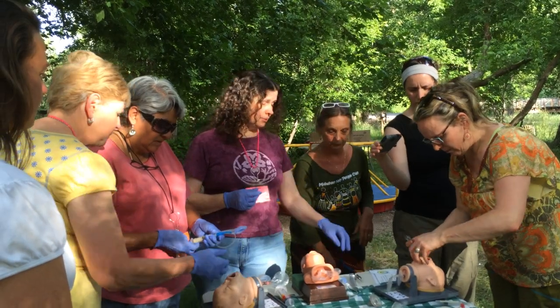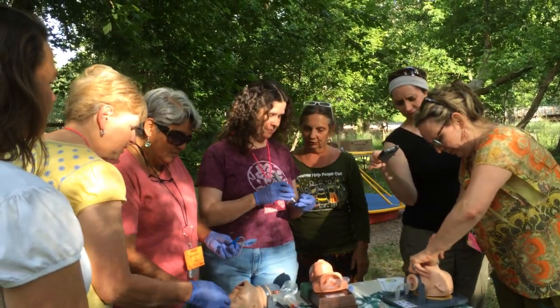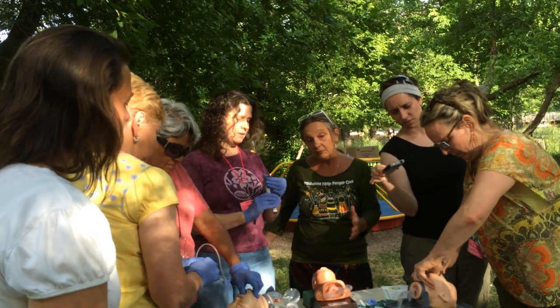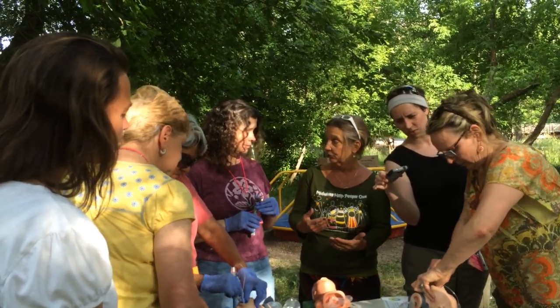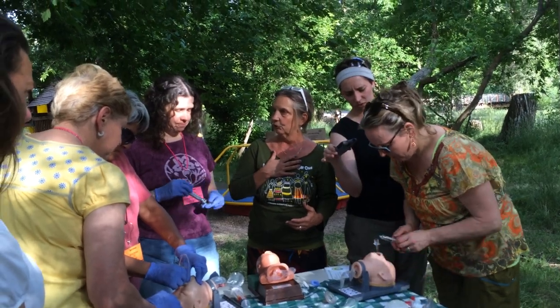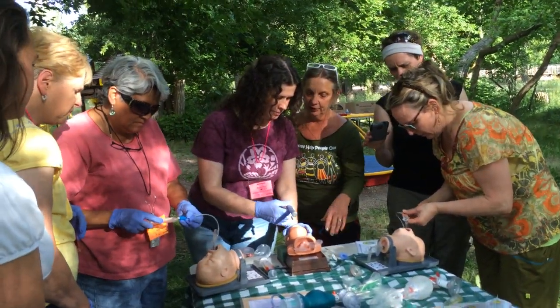Well, this is my first experience with LMA. I've never seen one. This is a laryngeal mask airway. I've just never seen this until today. Yeah, it's part of every NRP program, but most out-of-hospital practitioners don't go into the intubation, so they never learn it. I've been teaching it for over 10 years. Almost every midwife in Indiana carries one.